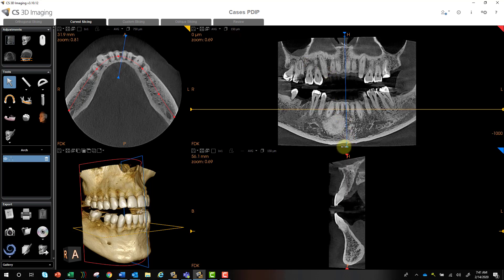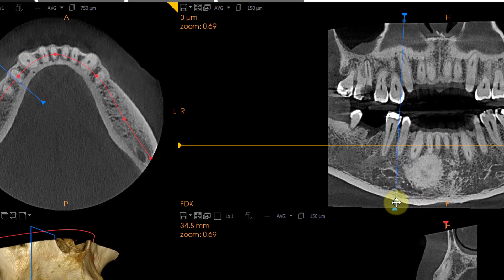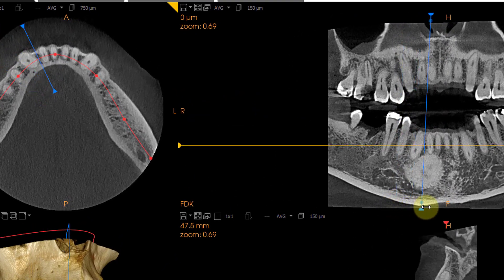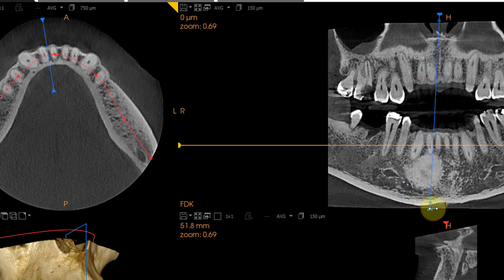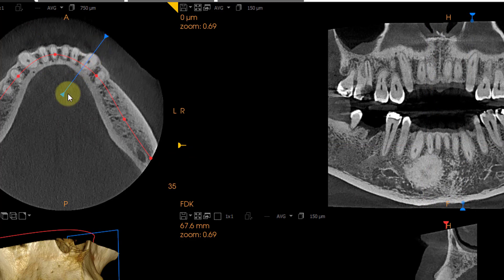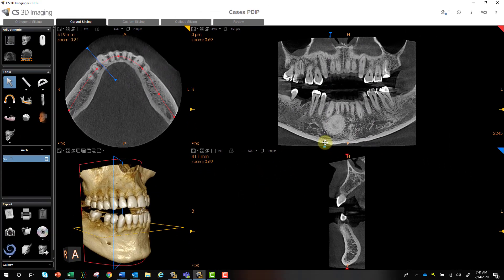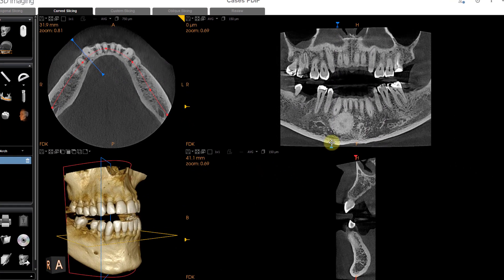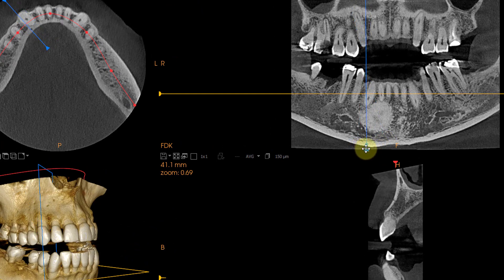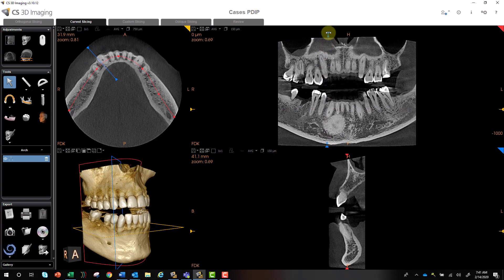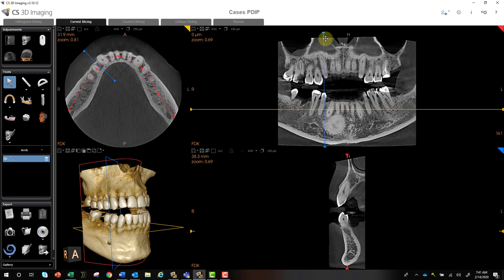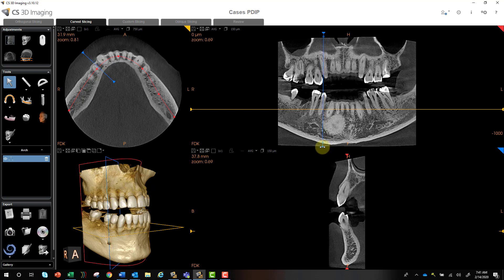In this case, I'm going to move my cross-sectional — my blue cross-sectional view. You can see here my two arrows move my cross-sectional view around the arch. If you look in the upper left-hand view, you can see my perpendicular cut moving around the arch. When I move my mouse over the four arrows, you can see this changes the angle of that cross-sectional view. Two arrows moves around the arch; four arrows changes the angle.